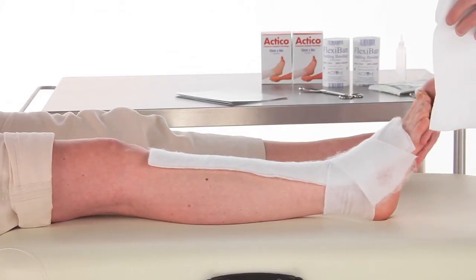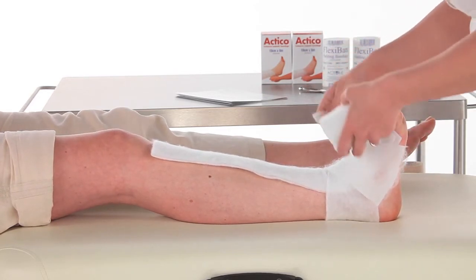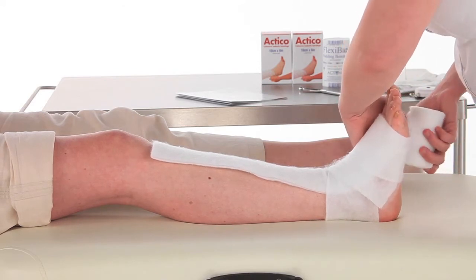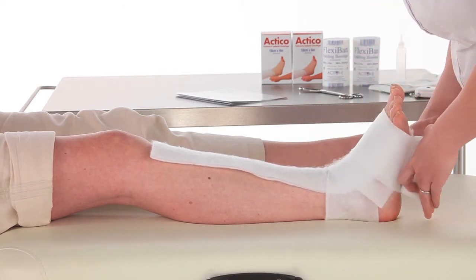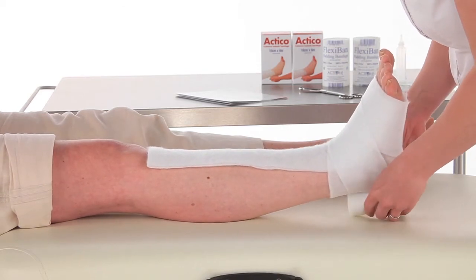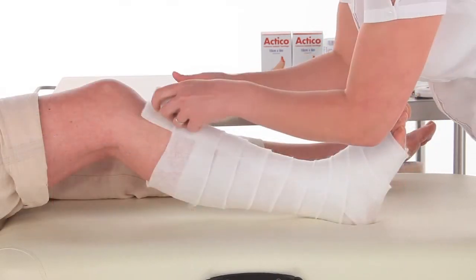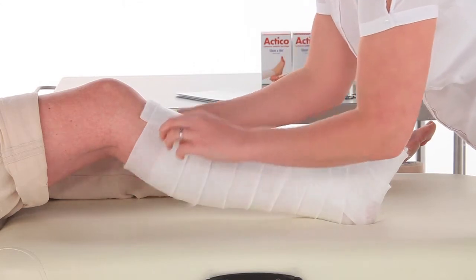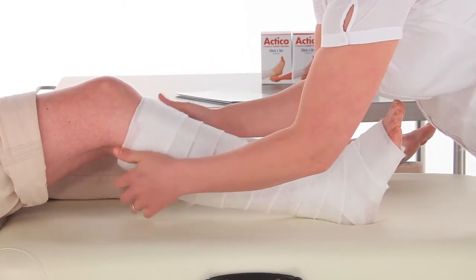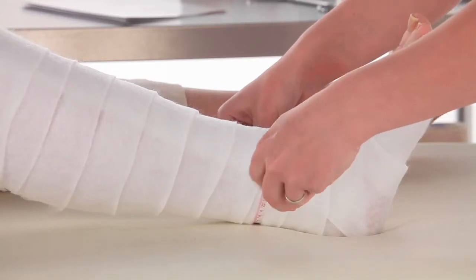Please position the foot toes to nose when applying the padding. Secure the padding with two turns at the base of the toes and with a figure of eight at the ankle, before using a 50% overlap spiral up the leg. Finish the padding two centimetres below the popliteal fossa.